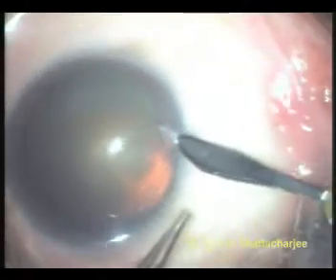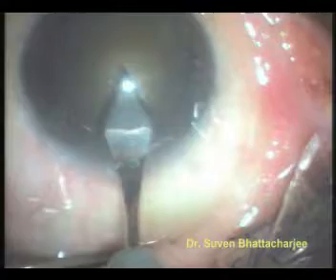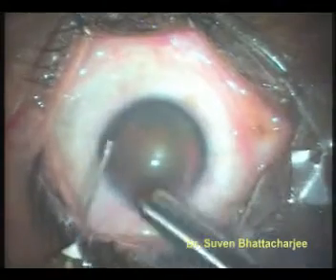The patient can have a normal shower the day after the surgery. After making two 1 mm side ports, a main incision measuring 2.8 mm is made. A viscoelastic jelly is injected into the anterior chamber between the cornea and the cataract.